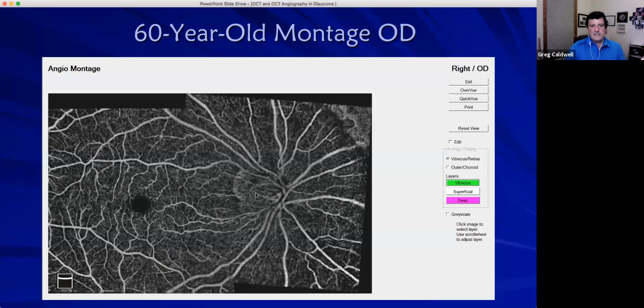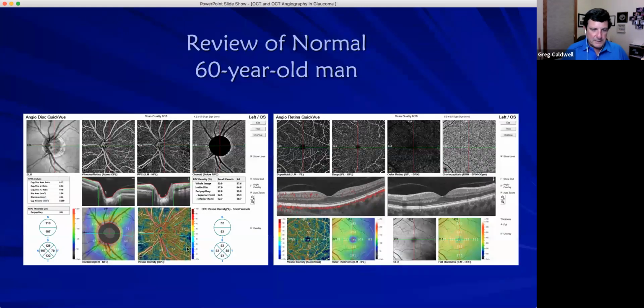And this is what OCT used to look like when I first got it. One thing I like about the OptiView unit is you can get these measurements. I don't think there's any other unit out there, and I'll take that with a grain of salt. I am going to SECO this week, and I am going to chat with Zeiss and Heidelberg and all the different companies in their exhibit hall. At least during COVID, I've been trying to keep my finger on the pulse.